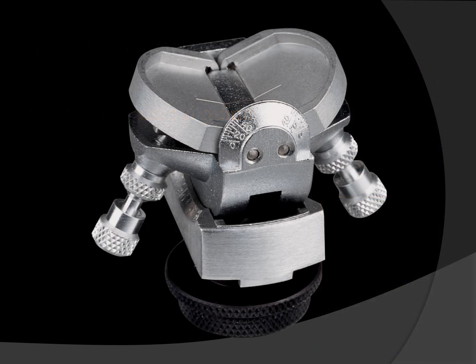Here in this picture you can very well appreciate the incisal guidance parts. This is the incisal guide table, 5.56 millimeter wide. It has two components, anterior-posterior and the lateral component. Anterior posteriorly this can be adjusted from 0 to 60 degrees and secured into position by means of a small lock nut here, and the lateral wings can be adjusted from 0 to 45. You can see the calibrations here, 0 to 45 degrees by means of an elevating thumb screw and locked by a thumb nut here. So these are the two components, and we know that the incisal guide pin should rest on the center of the incisal guide table during articulation.